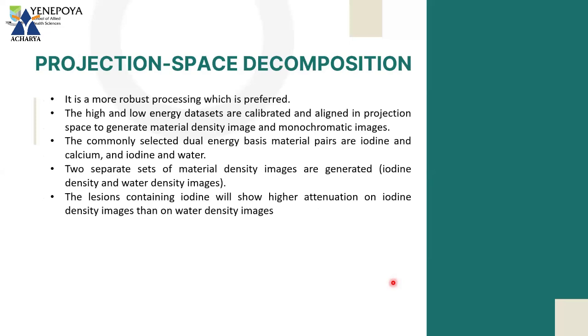decomposition. Next, we have the projection space decomposition. So what is projection based?